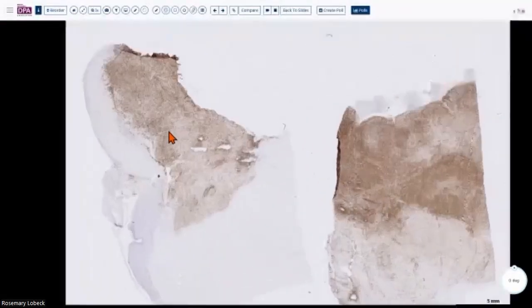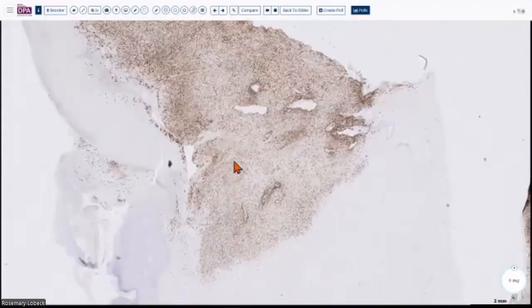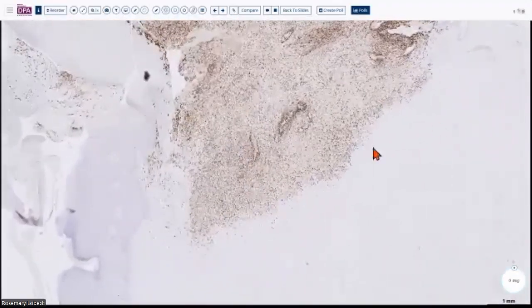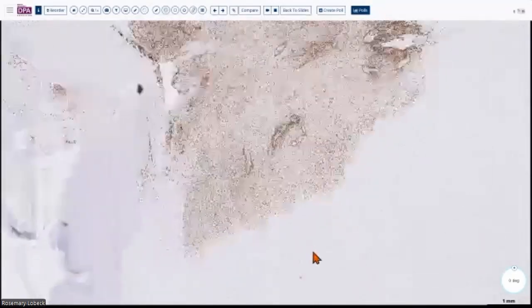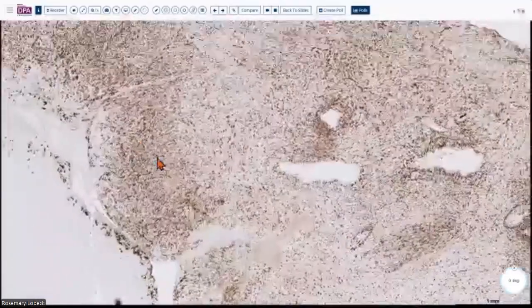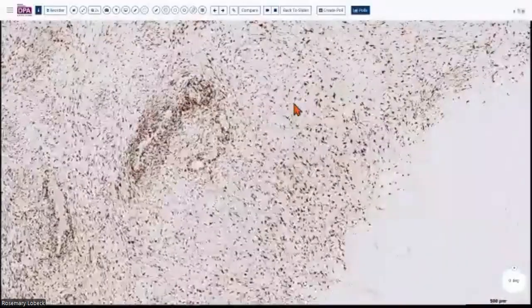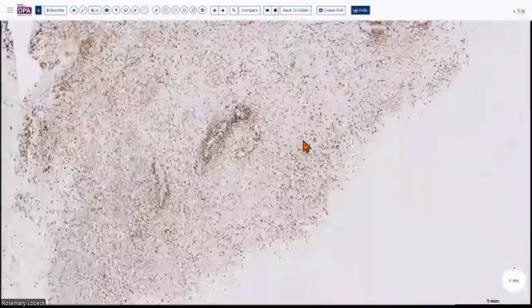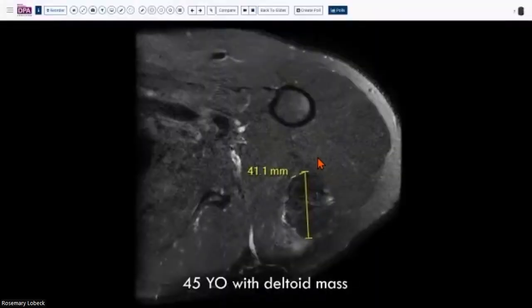This stain is MUC4. So you could see, again, MUC4 beautifully highlights the distinction between the lesional tissue over here and the scar. So it's diffusely strongly positive in the more cellular areas underneath the wound and also in the less cellular areas over here. So this can mean only one diagnosis in this setting, and that's going to be a low-grade fibromyxoid sarcoma that was mistaken for a healing wound.